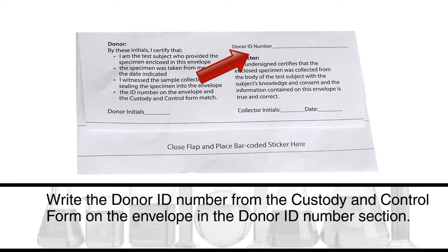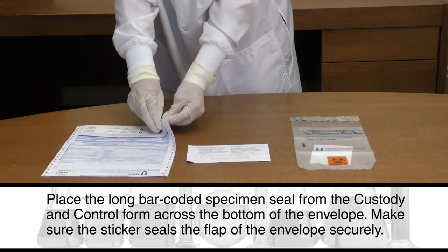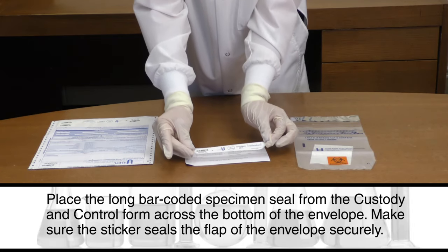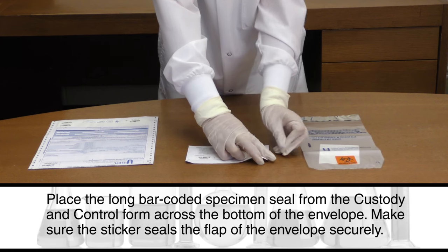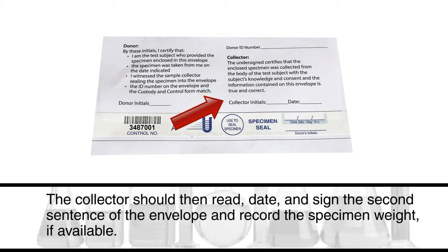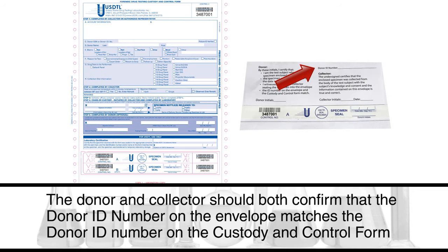Write the donor ID number from the custody and control form on the envelope in the donor ID number section. Place the long bar-coded specimen seal from the custody and control form across the bottom of the envelope, making sure the sticker seals the flap securely. Have the donor read and initial the first sentence on the envelope and date and initial the bar-coded specimen seal where donor initials is indicated. The collector should then read, date, and sign the second sentence of the envelope and record the specimen weight if available. The donor and collector should both confirm that the donor ID number on the envelope matches the donor ID number on the custody and control form.